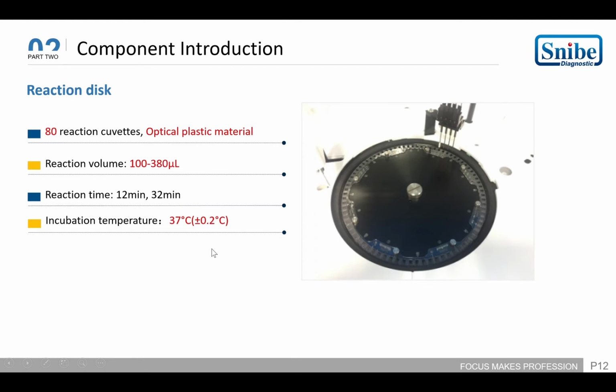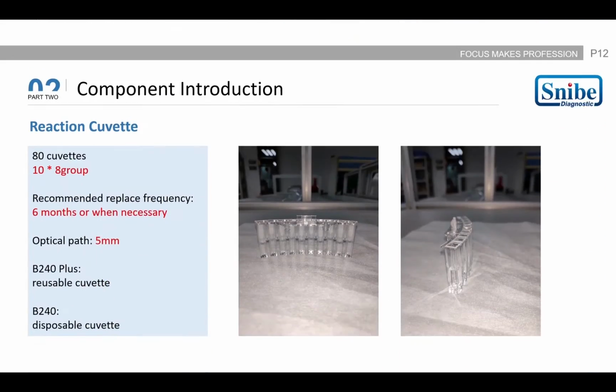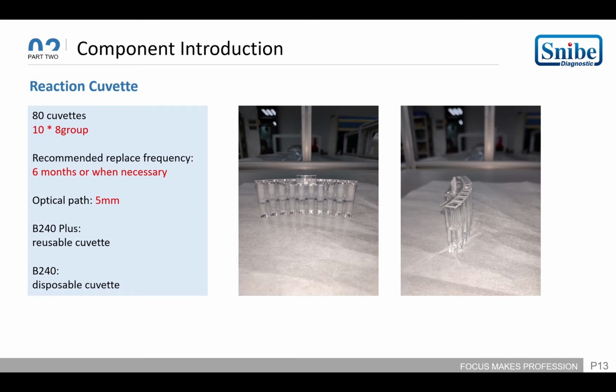Now we are going to see more detail about the reaction cuvettes. You can see 1, 2, 3, 4, 5, 6, 7, 8, 9, 10. 10 cuvettes, one group. And we recommend that you replace the cuvettes in 6 months or when necessary.